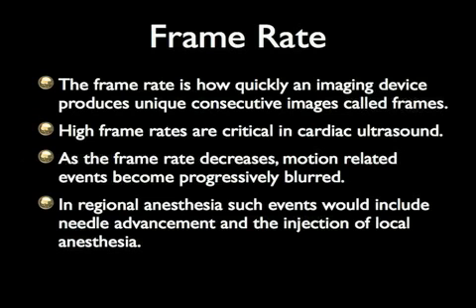The next topic will be that of the frame rate. The frame rate is how quickly an imaging device produces unique consecutive images called frames. High frame rates are critical in cardiac ultrasound. As the frame rate decreases, motion-related events become progressively blurred. In regional anesthesia, such events would include needle advancement and the injection of local anesthesia.